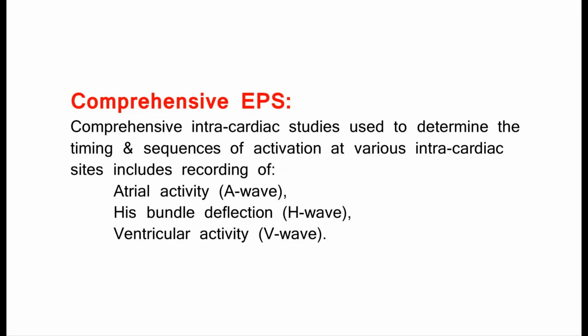Comprehensive EPS. Comprehensive intracardiac studies used to determine the timing and sequences of activation at various intracardiac sites include recording of atrial activity, A wave, His bundle deflection, H wave, and ventricular activity, V wave.